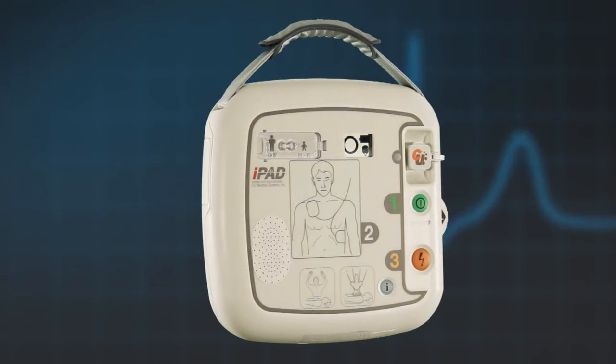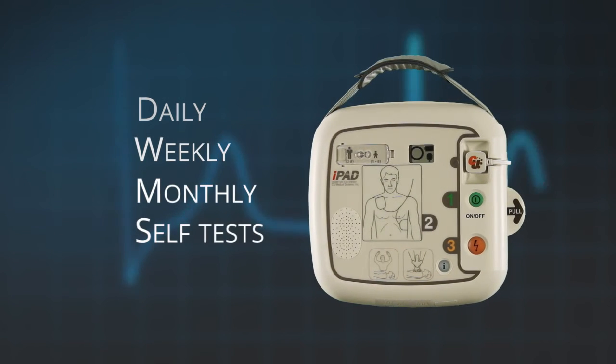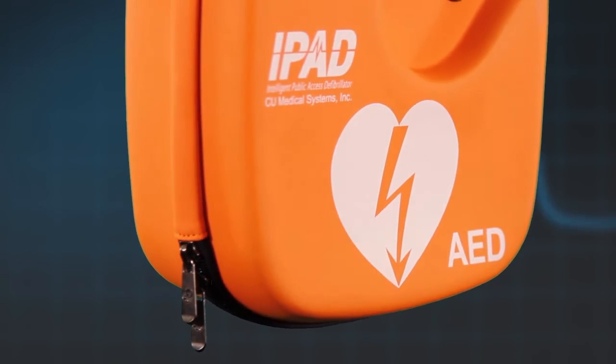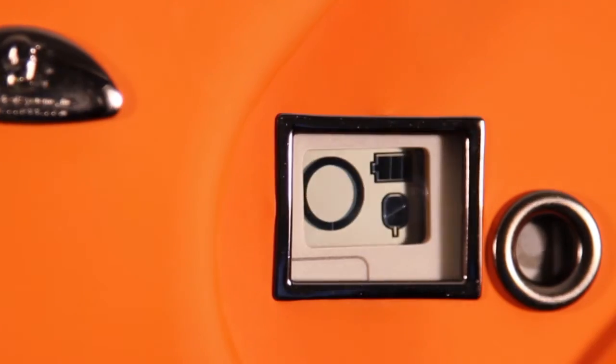The iPad SP1 AED performs a daily, weekly, and monthly self-test. However, it is still important to visually check your AED on a regular basis. This is done simply by looking at the unit status window, which is visible through the carrying case. This window shows three key things.